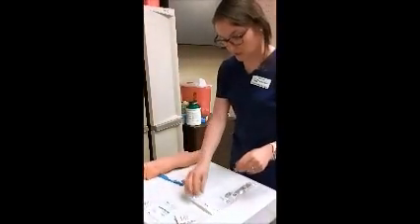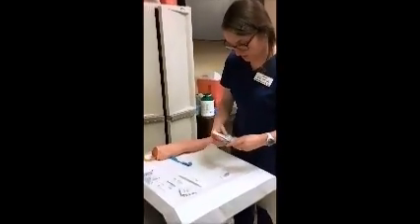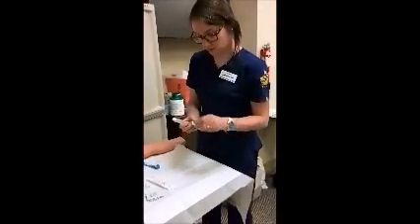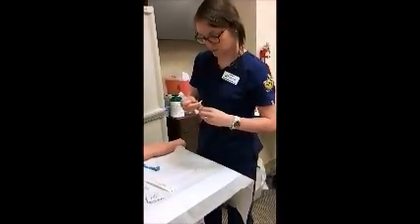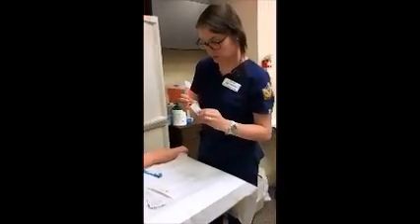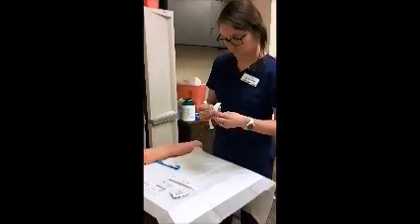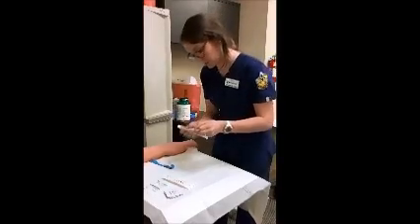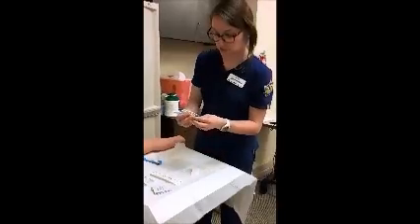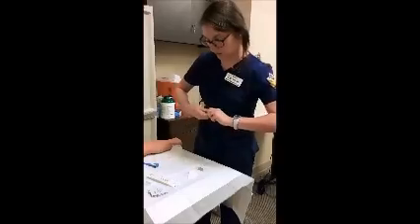So having already performed hand hygiene, we can go ahead. We'll prime our saline lock. Just being very careful. We really want to maintain sterility at all points during this. This one was in there backwards. That happens sometimes. So what I'll do is take this off. I'm still maintaining sterility here. I have a hard time getting these off.